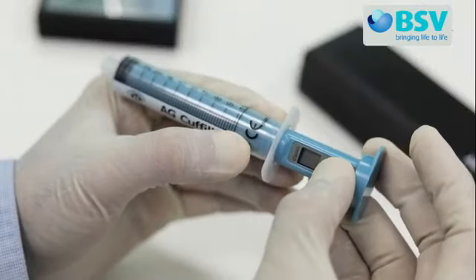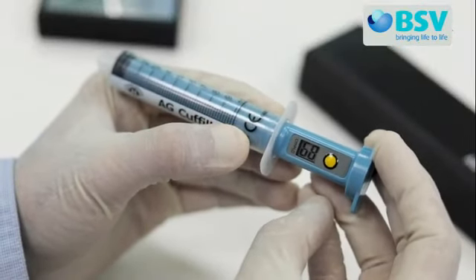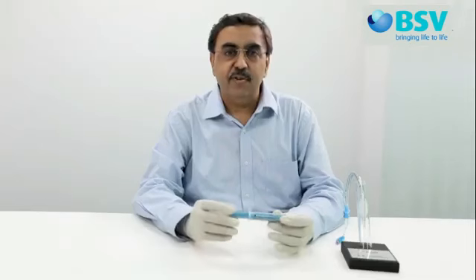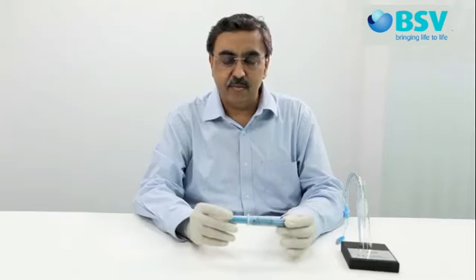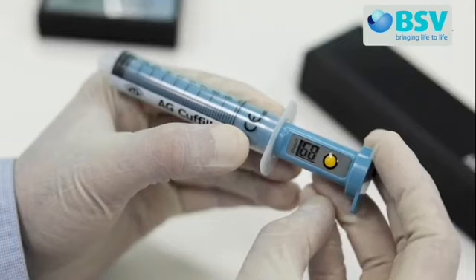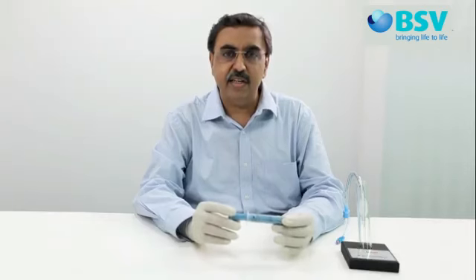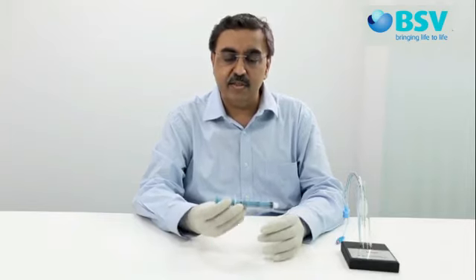When you switch on the device by pressing the yellow button, the device checks itself and calibrates automatically. The first reading displayed on the LCD is the number of readings remaining out of 100, followed by 00, indicating that AG Cuffil is ready for use. If the device displays any number other than 00, it means the device requires calibration.